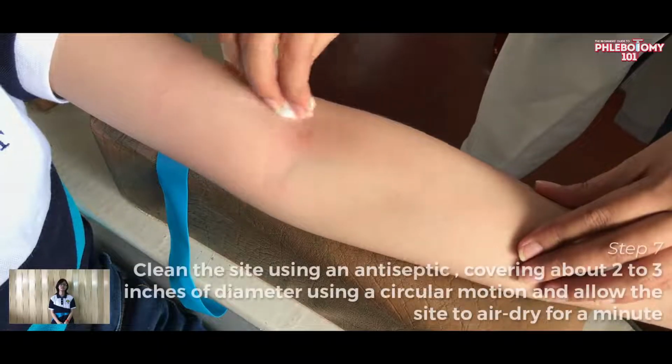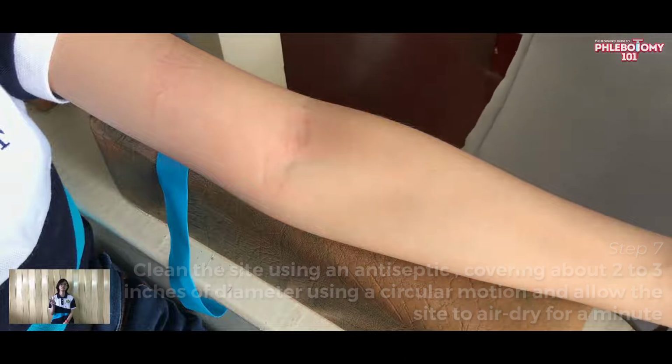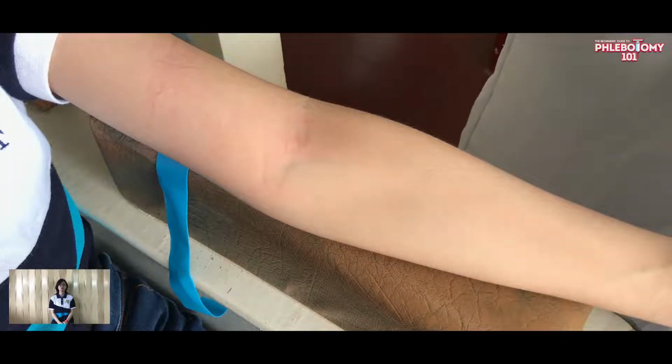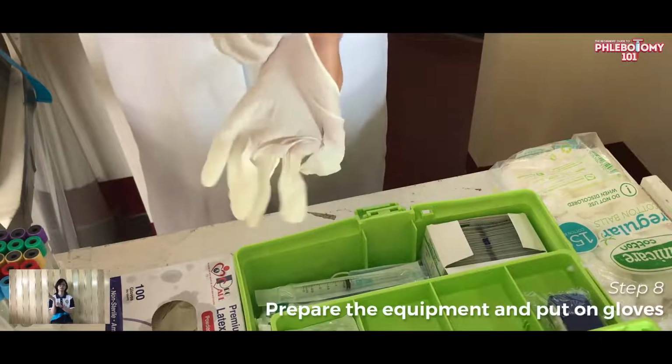Step 7 is to clean the site using an antiseptic, covering about 2 to 3 inches of diameter using a circular motion, and allow the site to air dry for about a minute. Step 8 is to prepare the equipment and put on gloves.